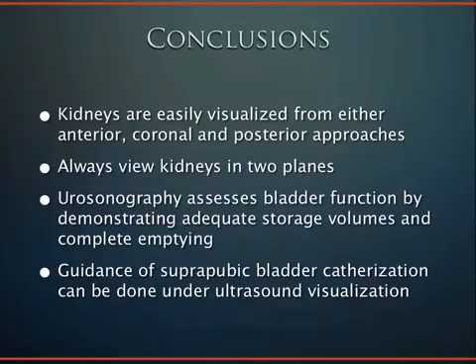The kidneys are really easily visualized, actually. Anterior coronal planes, even posterior approaches. Today you'll be using all three approaches. You're going to be looking at the kidneys in two different planes, both longitudinal and short axis.